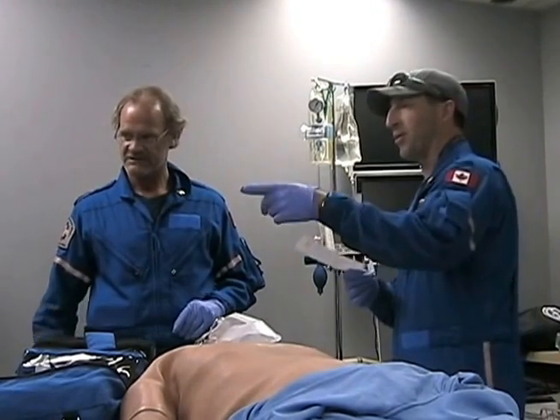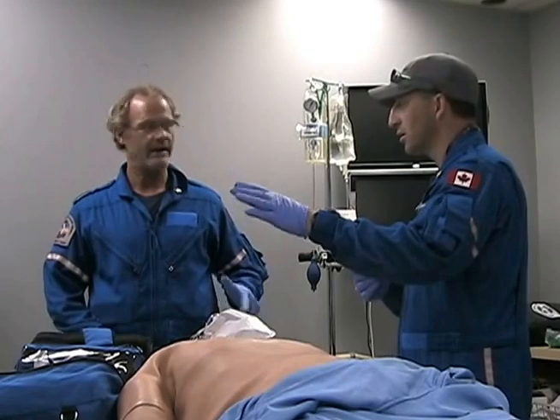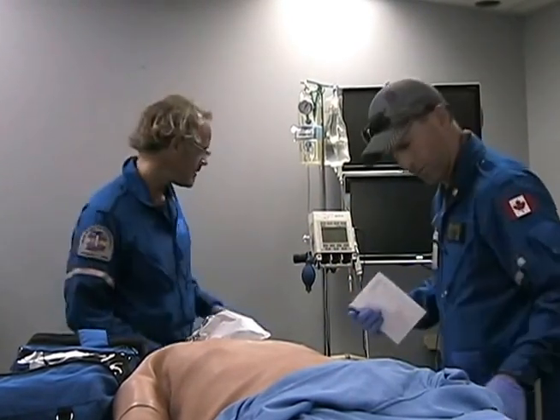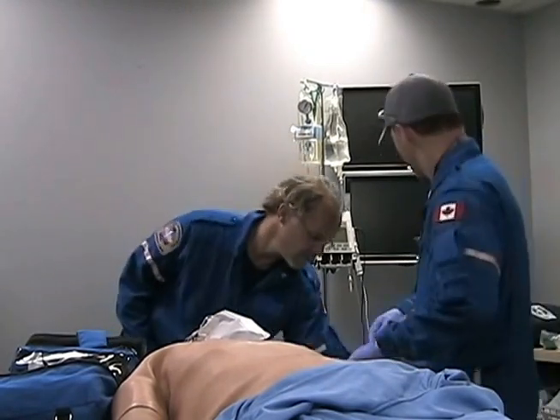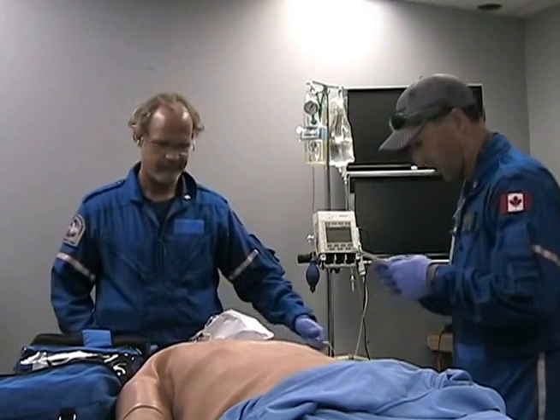Vital signs assessed. Oh yeah, so his blood pressure is okay. He's a bit tachycardic, but I think he's okay. Sats were 99 too. Okay, so they're good. Okay, we've assessed that. IV functional. Oh, let me just make sure. Right here. Okay, I'll just make sure it's working there. Dripping? Yeah, I think it's okay. Okay, good. That looks pretty good.